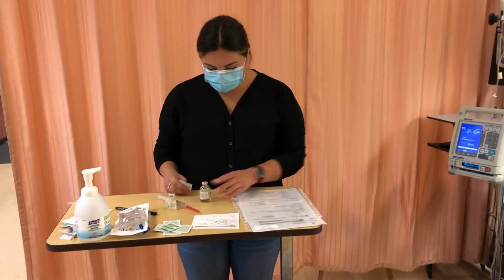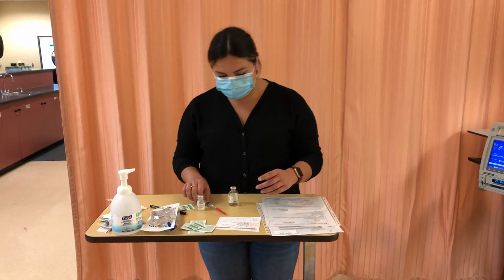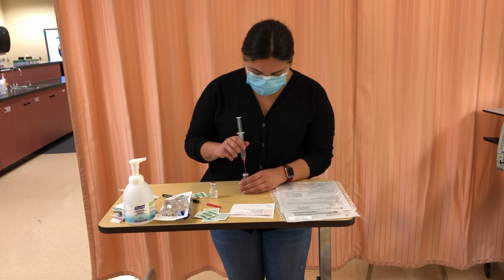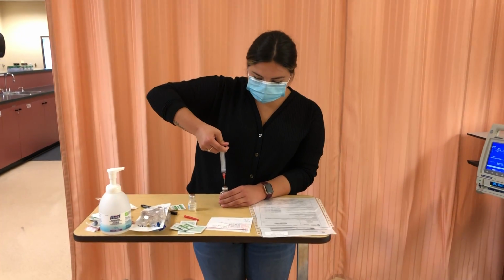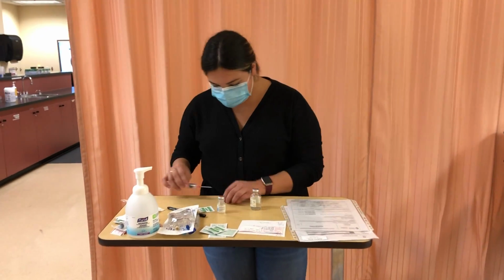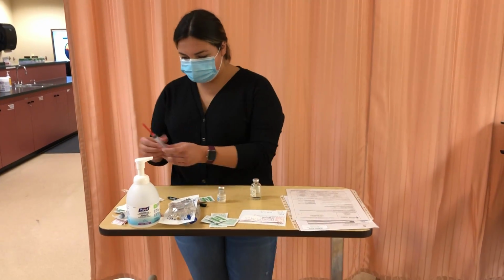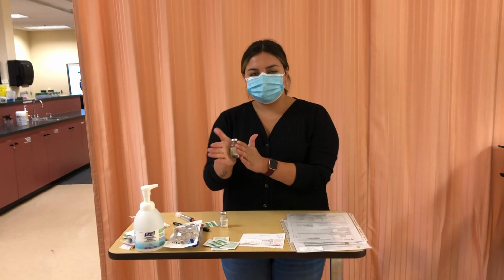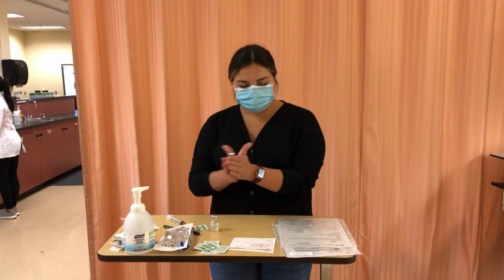So I'm going to put that into my cloxacillin vial. So I'm cleaning the top for 30 seconds and allowing it to dry. So administering 6.8 milliliters of sterile water to reconstitute this medication. I will also be doing vital signs frequently. So again, if you experience any of those side effects that we talked about, please let me know. And I'm just going to roll this between my hands to dilute the powder into the liquid and ensure that there are no sediments.